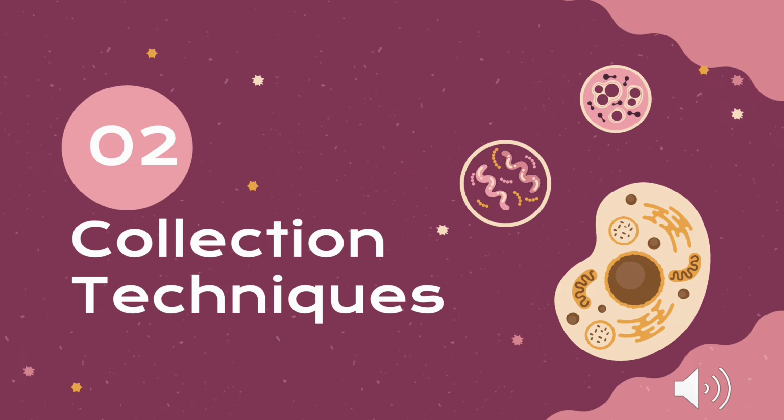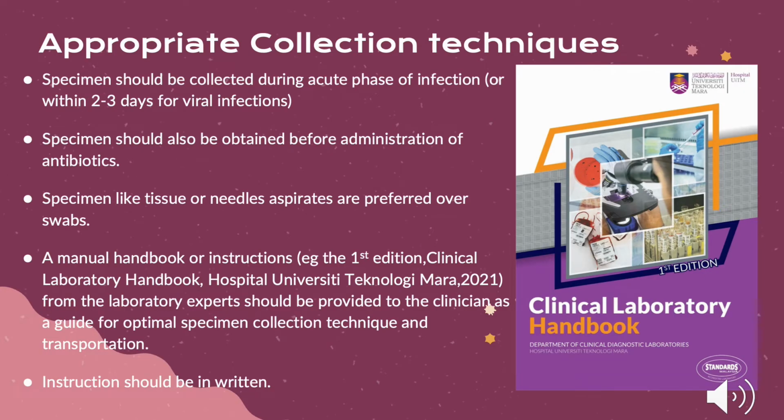Next is collection techniques. These are a few considerations of collection techniques that need to be practiced in ensuring that a quality specimen is obtained. First, specimens should be collected during the acute phase of infection, or within 2 to 3 days for viral infections. Next, specimens should also be obtained before administration of antibiotics. Specimens like tissue or needle aspirates are preferred over swabs.